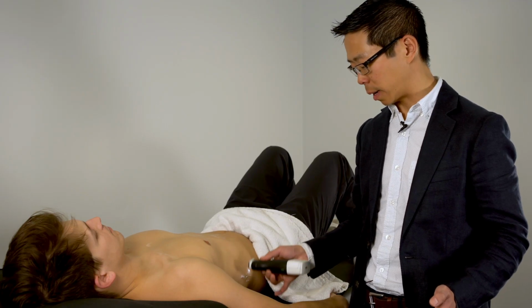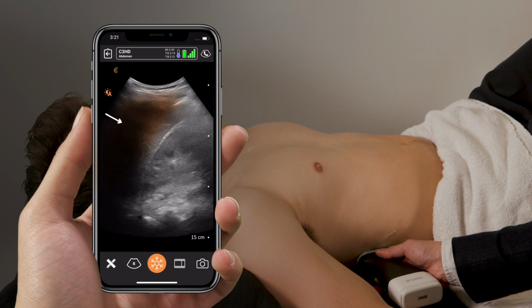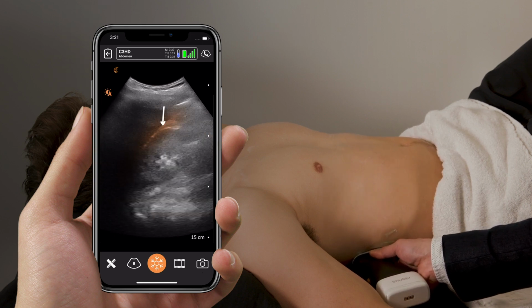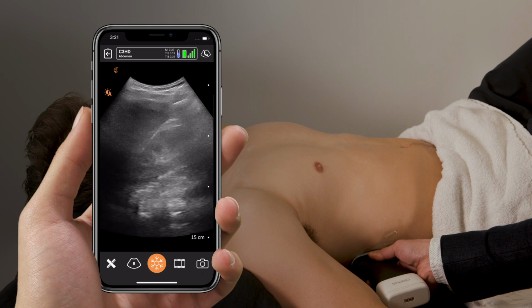First place we're going to start is the right upper quadrant. We're going to place our probe here to identify the liver and the kidney. The bright white line in between is called Morrison's pouch. The idea here is that we want to scan through this interface because it's one of the more sensitive areas in the upper abdomen for free fluid.